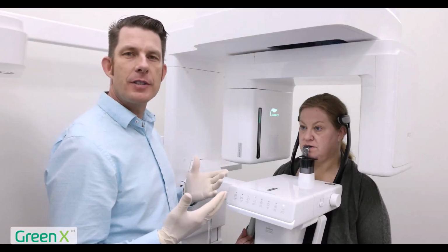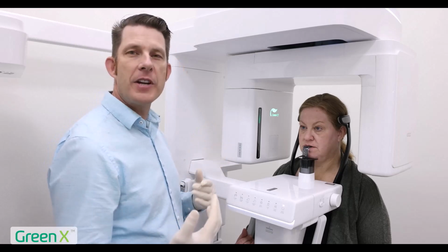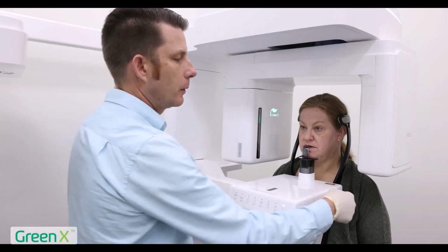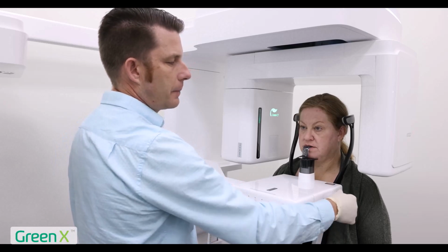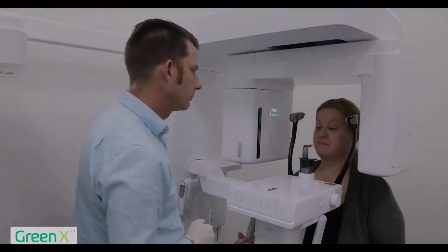Once image capture is complete and the overhead stops rotating, we can let our patient out of the device. I'm going to go ahead and release the temple supports by opening them here with the wheel. We can go ahead and have our patient step out of the machine.